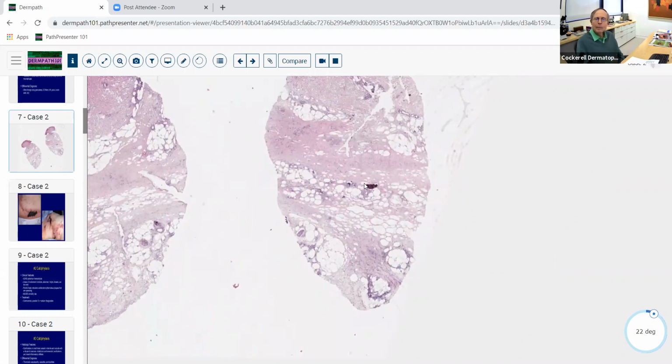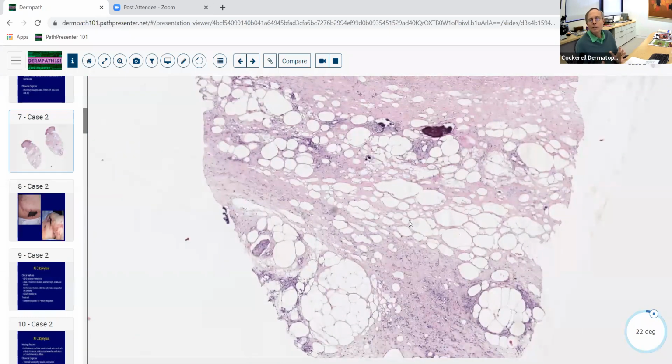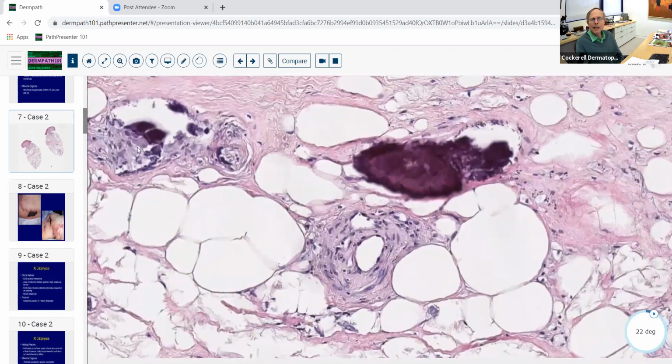And we've talked a little bit about paniculitis. So this is going to be a lobular, mostly paniculitis. Notice that all the lobules here are involved. Septa involved too, but it's mostly lobular. And going to higher magnification, you see that there's this extensive calcification involving these blood vessels. It's not a large blood vessel, but it's certainly not a tiny capillary sitting down here in the lower part of the dermis, subcutaneous fat.